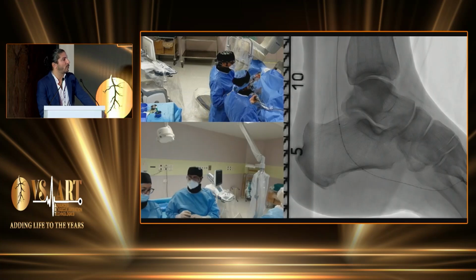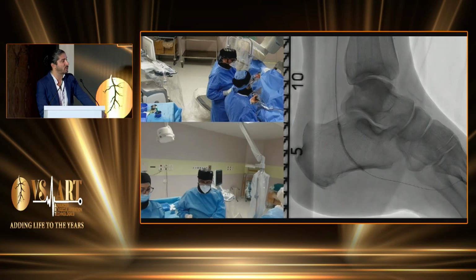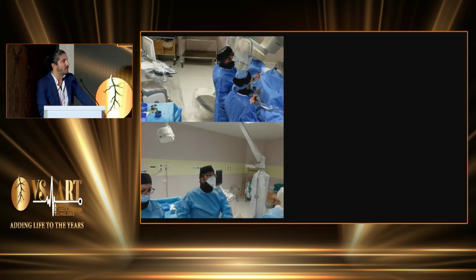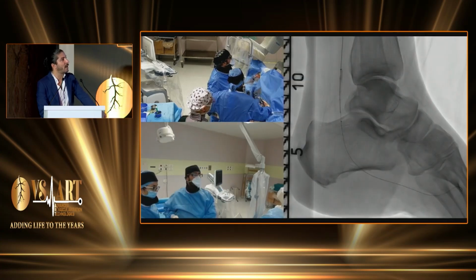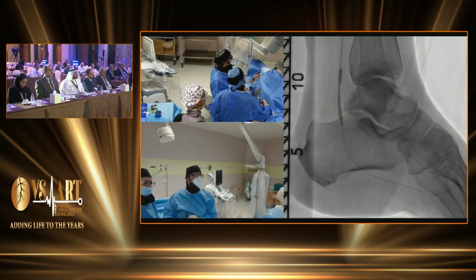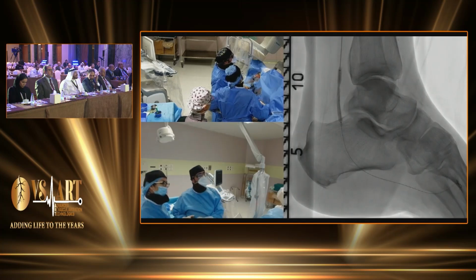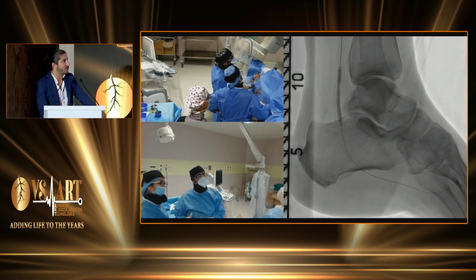We use all the pulses and all the cycles that we have in the balloon to be able to treat as much as possible and to prepare as well as possible this distal posterior tibial and this lateral plantar. And after this, we use a DCB. As always, we post-dilate with a standard balloon, and we use a DCB. In that case, a paclitaxel DCB was used to treat the lateral plantar and posterior tibial artery.